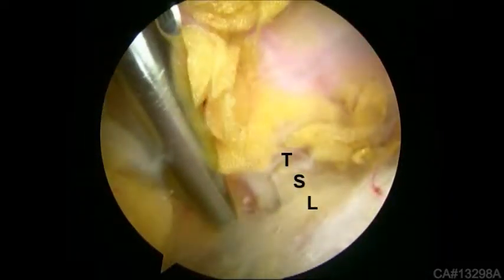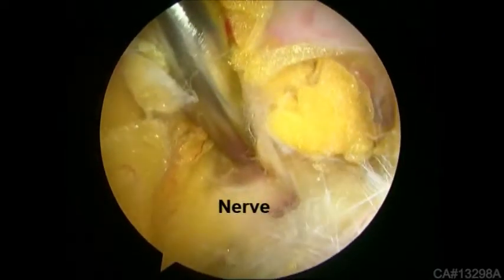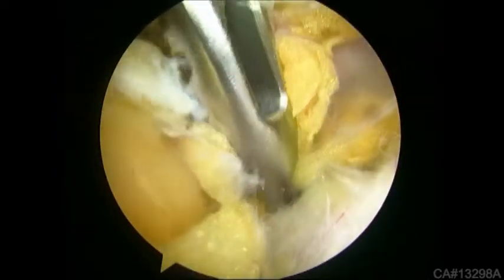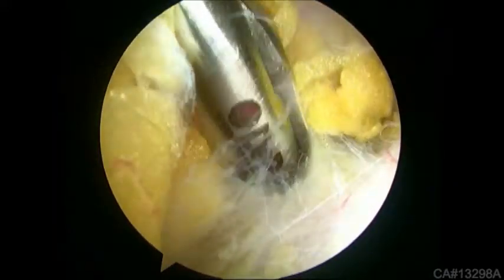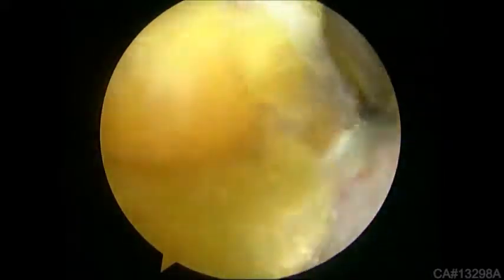Here, the TSL is clearly seen. Entering beneath the ligament is the suprascapular nerve. The ASTL easily passes into the notch, protecting the nerve and artery medially. The scissor transects the ligament, freeing the nerve from further compression.